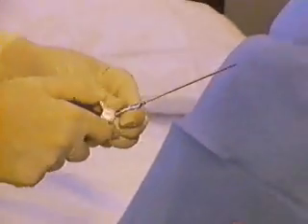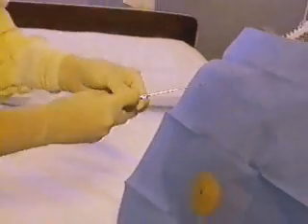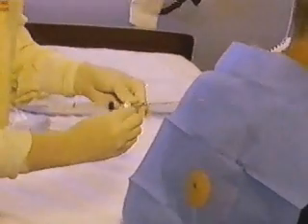Preparing to use the needle-only technique, she assembles the syringe and stopcock on the needle.